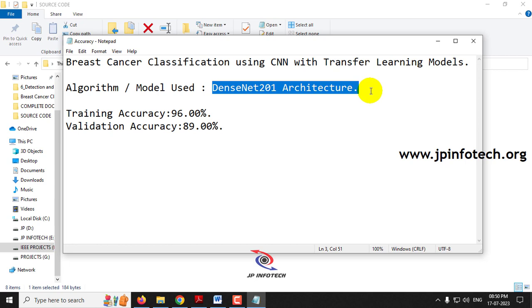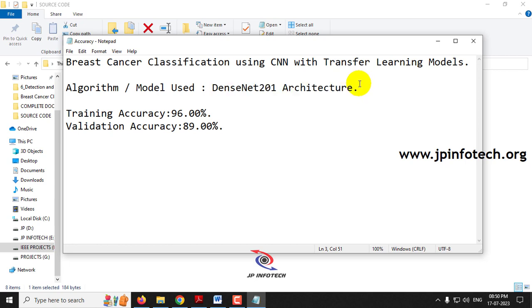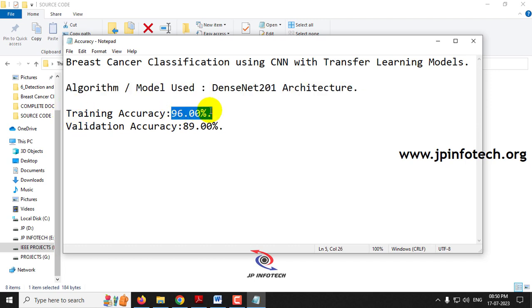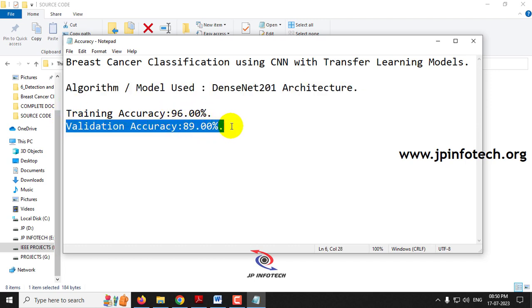This is our proposed algorithm or model to be implemented in the project. The training accuracy we achieved is 96% and the validation accuracy we achieved is 89%.